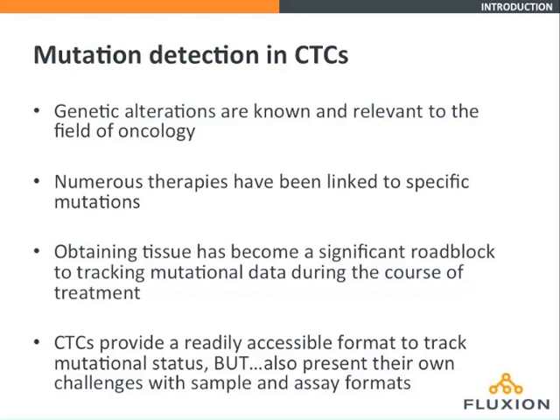However, tissue is a significant hurdle to fully utilizing this molecular approach. While the initial biopsy is often available, sometimes that is hard to come by, either due to the fact that tissue is in a place where it's hard to extract, but in all cases, monitoring the mutational status over time is not possible, either because the tumor has been excised or because there's just too much discomfort and risk to the patient.